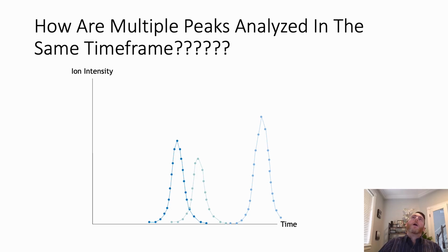And so this might be your chromatogram of looking for each one of these three compounds. One of the compounds was fully separated from the others, but the other two had some overlap, but that's okay because you have independent acquisitions at a very small time scale.